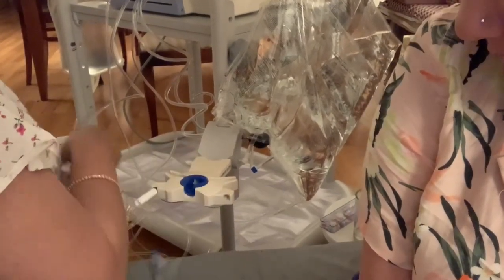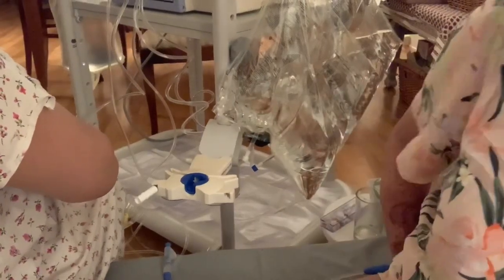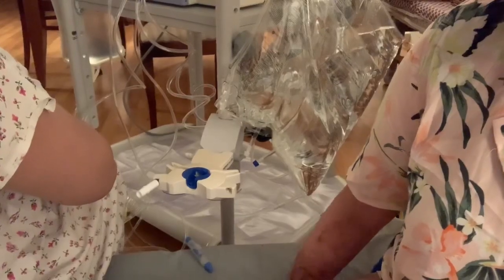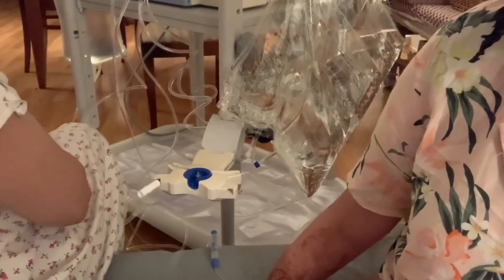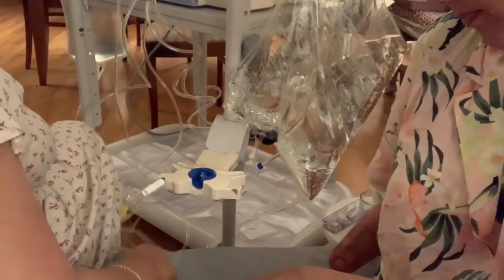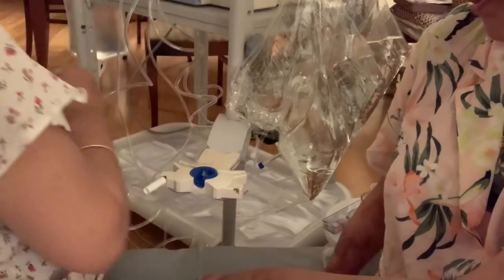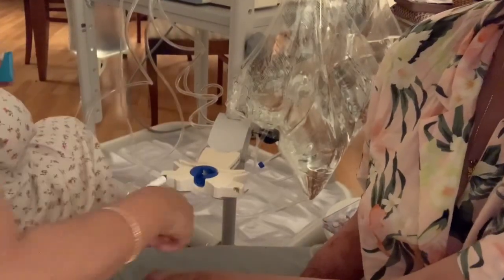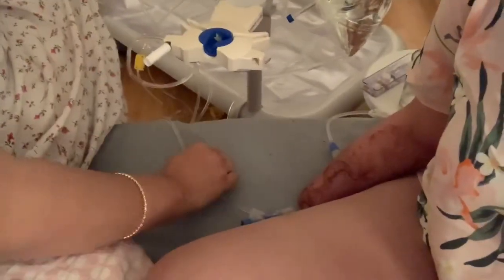There's a pretty long wire from the machine to me, so we basically just tape it to the mattress so it doesn't hang around everywhere and stays a little stable. When fluid is coming out in the cycles, it won't make a fuss when it's taped down.